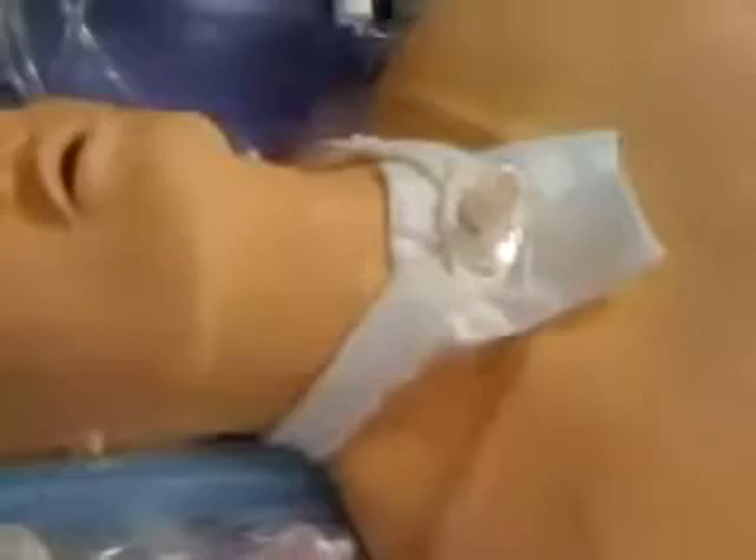Today I want to talk about tracheostomy tubes, specifically the fenestrated tracheostomy tube and how it works. Now this is not a fenestrated tracheostomy tube — you can tell that because this is a DCT, disposable cannula trach. So let me get one out and show you what a fenestrated tracheostomy looks like.